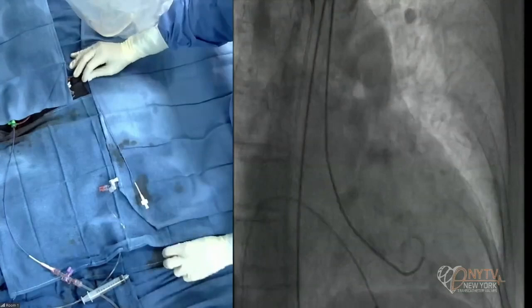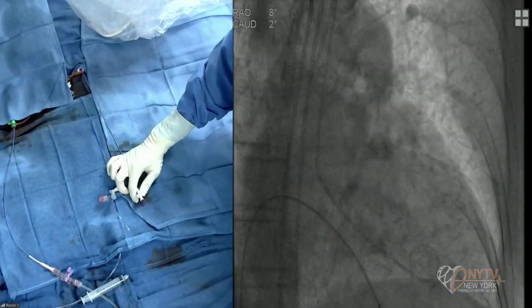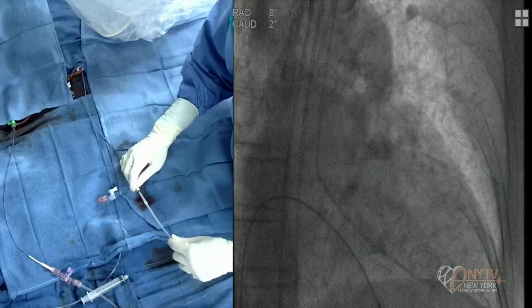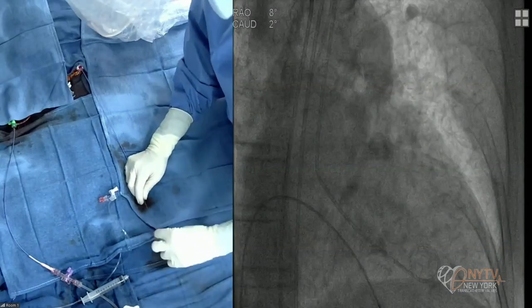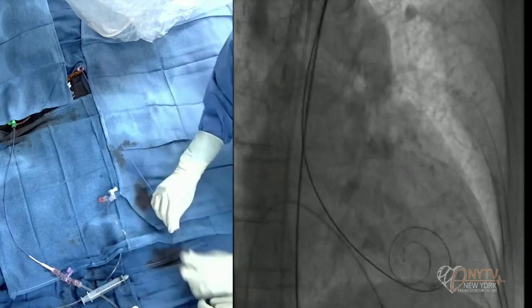Pressure came down a little for us. Great, 160. There's a very wide pulse pressure and extremely low diastolic blood pressure here, which correlates with a very significant chronic AR. The LV you can also see is on the dilated side, that's why the LVEDP is also under 20, as we saw.